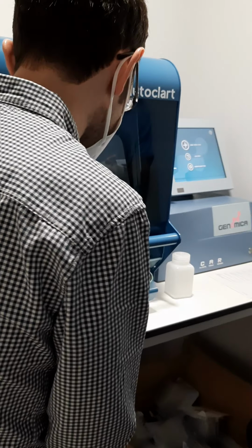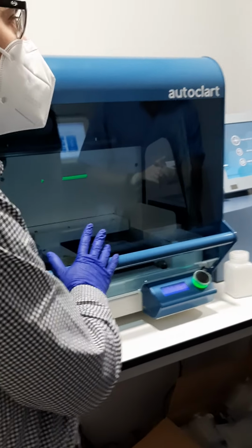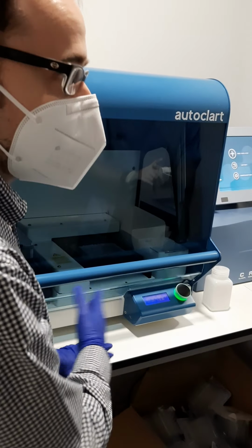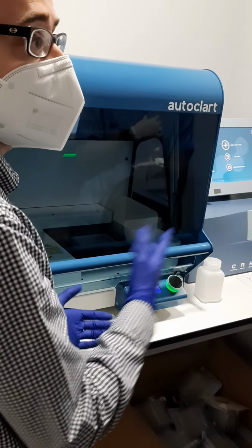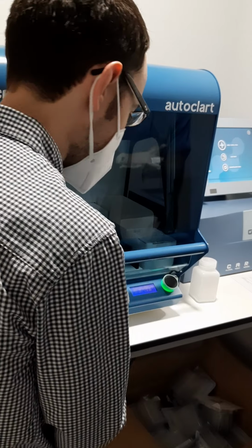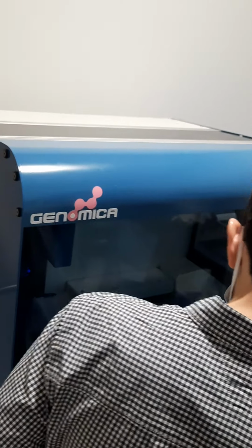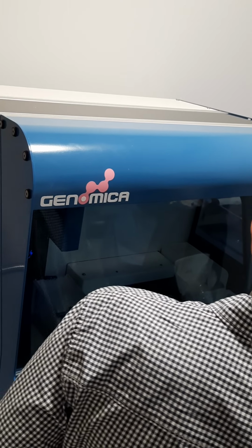But it's not happening. Here we don't have a PCR machine or something. We don't have amplification here, so there is no problem of contamination that we would have if there were amplification inside. Okay. So we run the OQ program, we select it. We are starting, the well is okay, so we say yes. Number of samples, we have 96 because it's going to add in different positions.